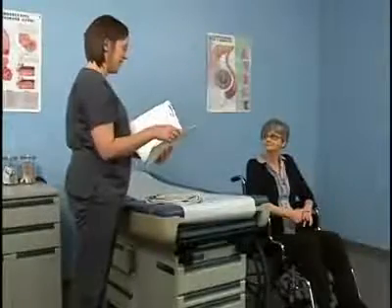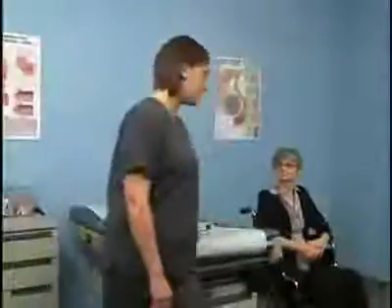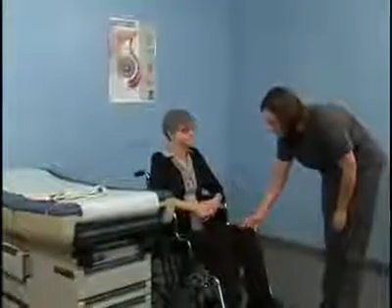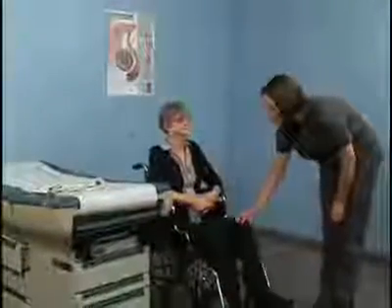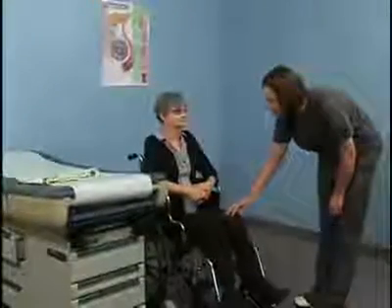Determine whether the patient has the mental and physical capability to perform the transfer. Estimate how heavy the patient is and whether the patient can provide assistance. Assess whether or not you are able to perform the transfer safely. Do not perform the transfer if you think you may incur a musculoskeletal injury.